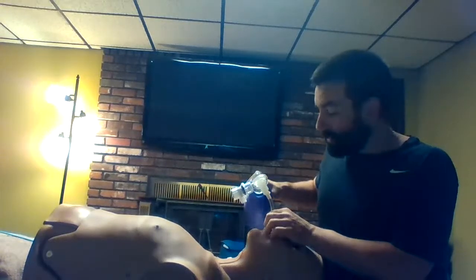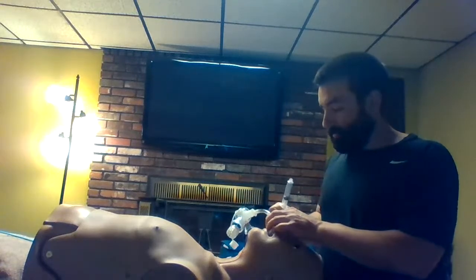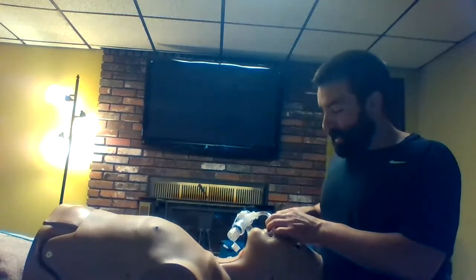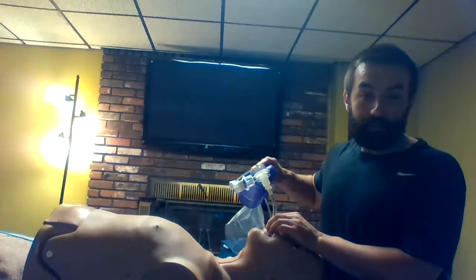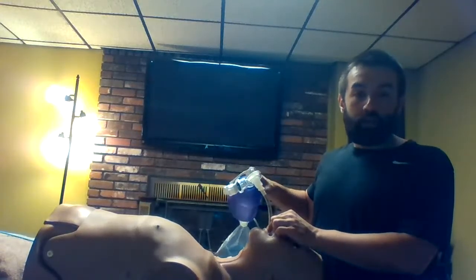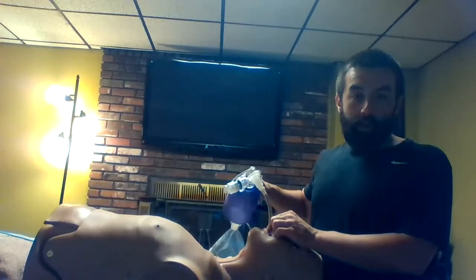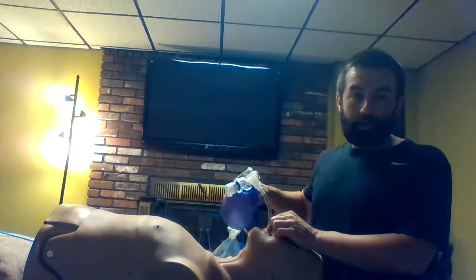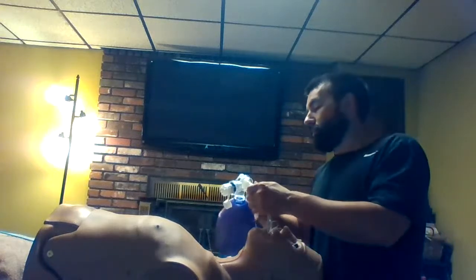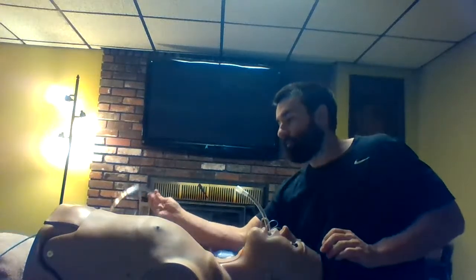Now, with this case, I got a little bit of an air leak here. I don't think I'm really deep down in that patient's trachea. Sometimes I still usually will check CO2, so put a colorimetric adapter on there, okay? But we should see, all right, we're 21 at the teeth, just like the old one. We exchange that tube. Now we can properly ventilate this patient and oxygenate them, and we could resume previous ventilation. We hook them back up to the ventilator or whatever.